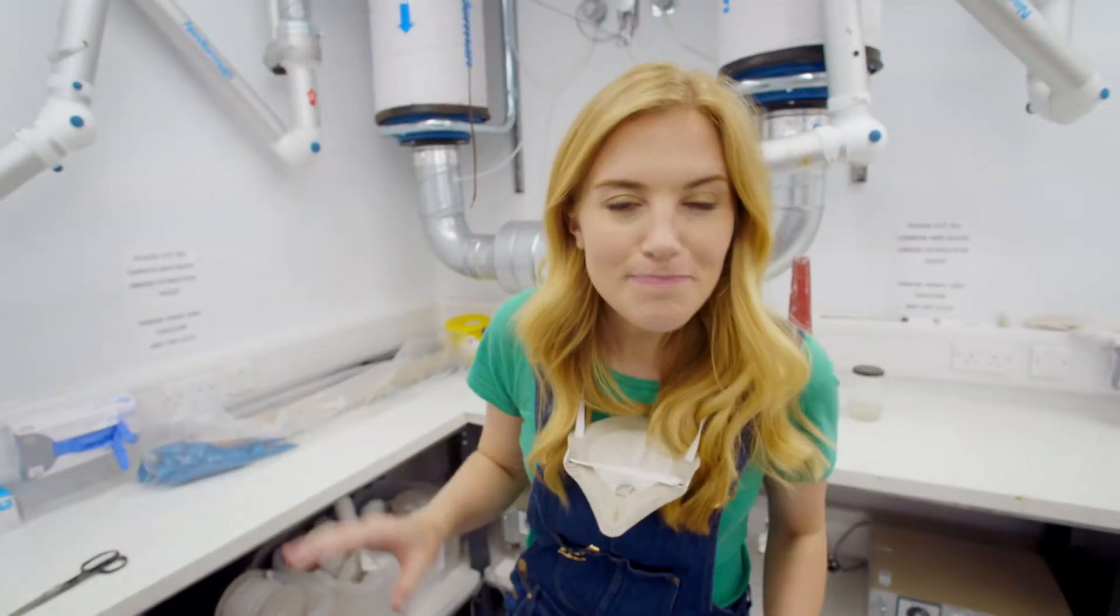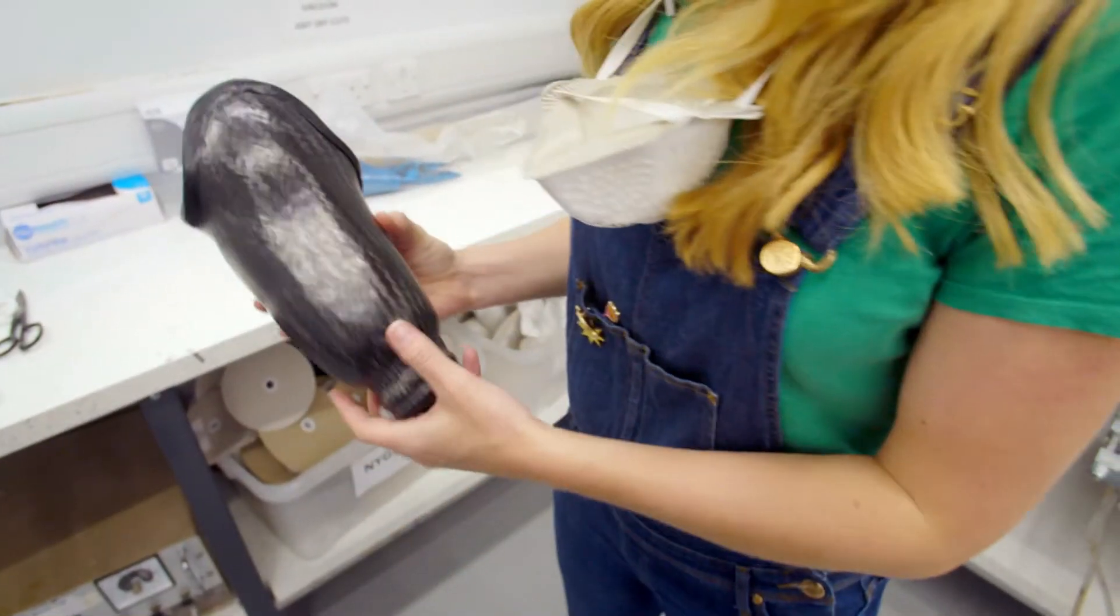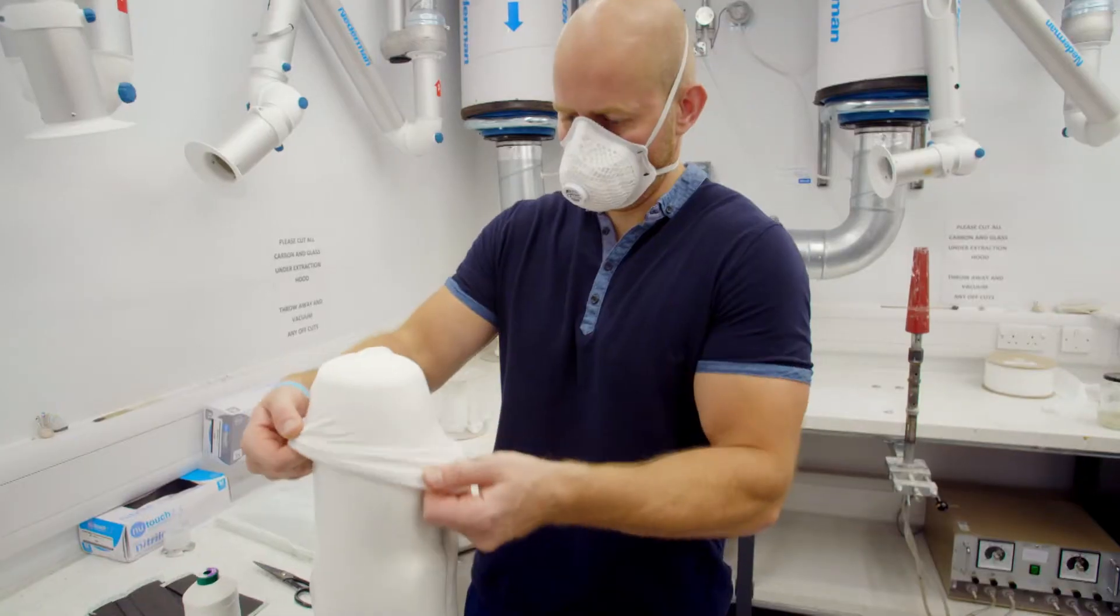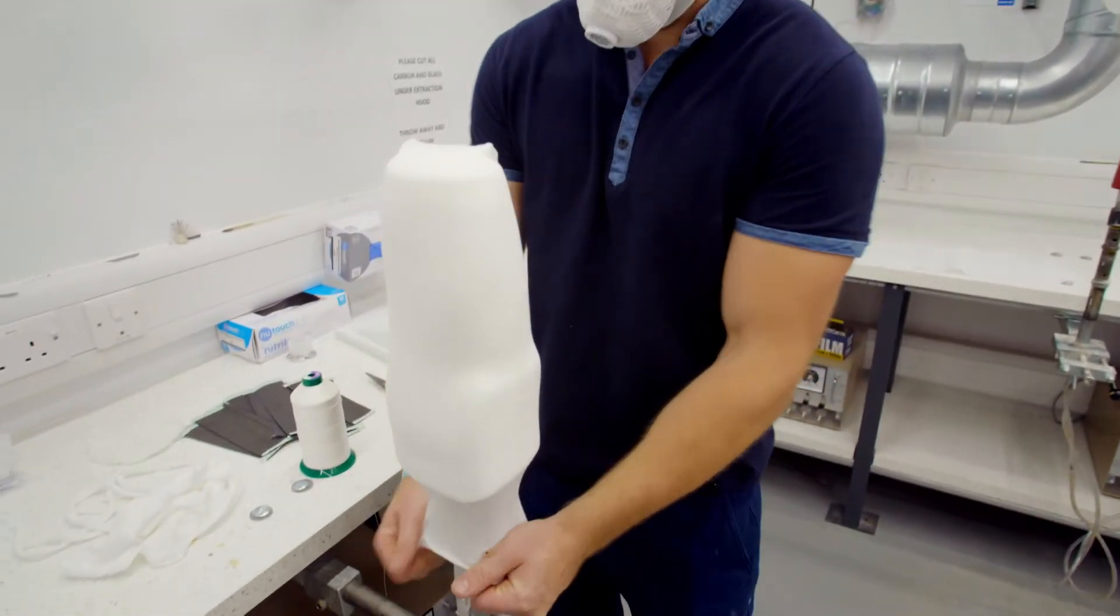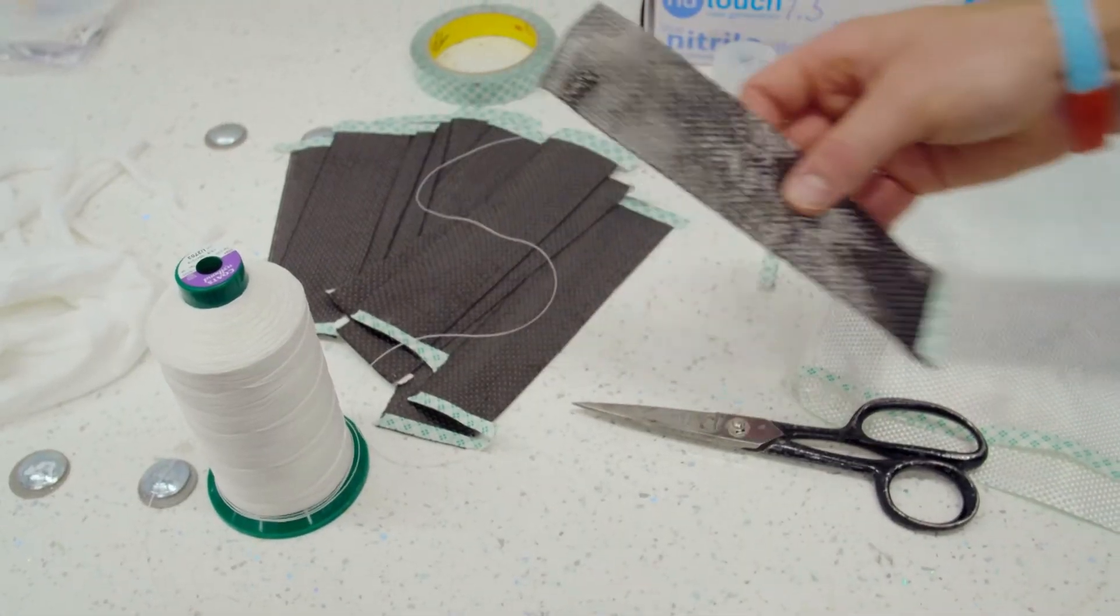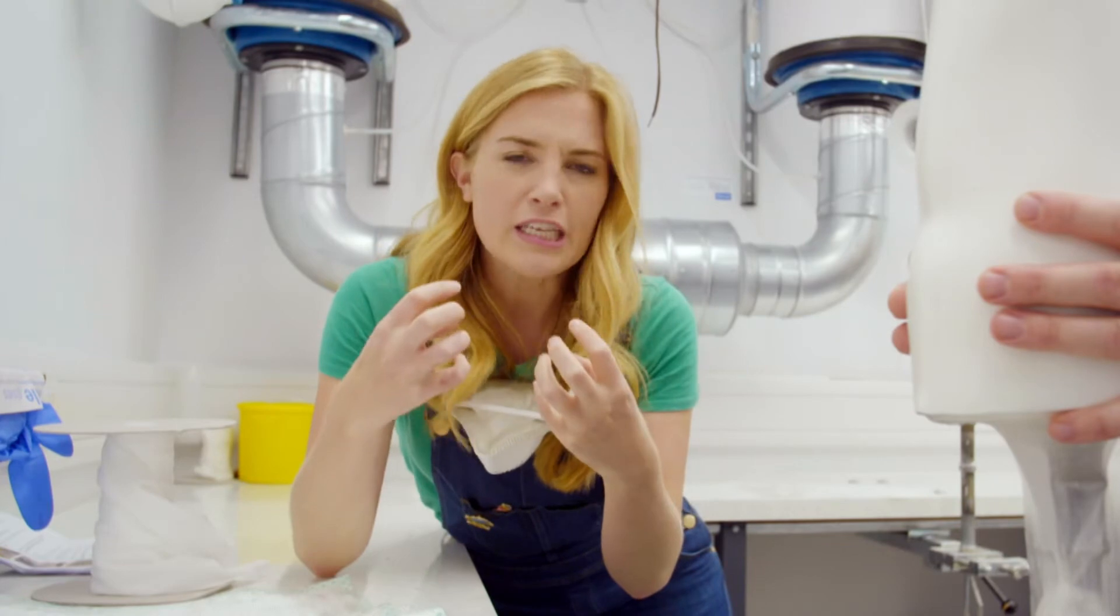The next part to make is called the socket. This is a hard shell, which is formed from three different materials: nylon, glass fibre and carbon fibre. These are really, really strong.